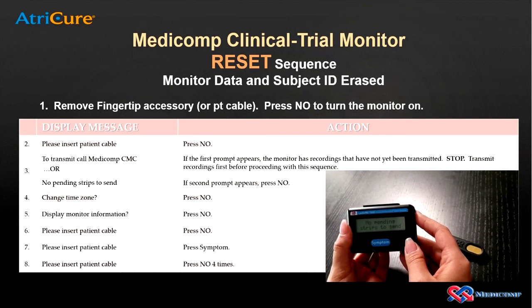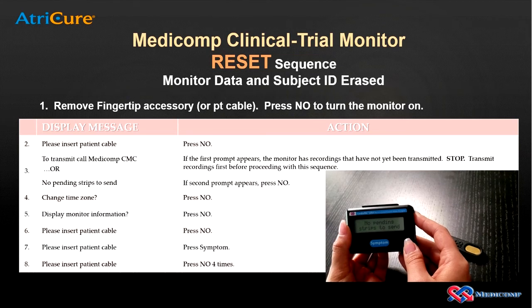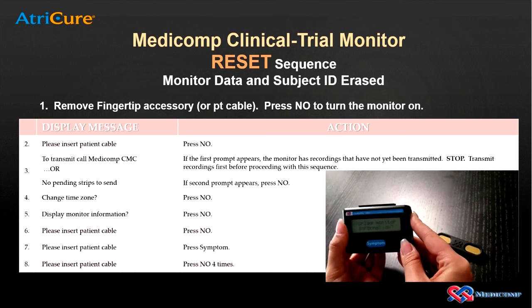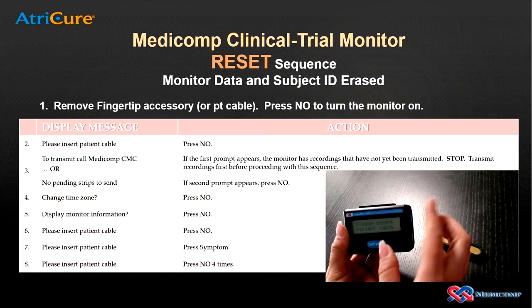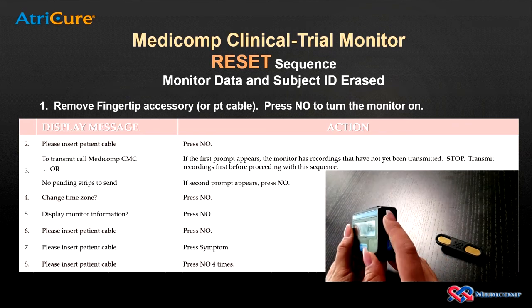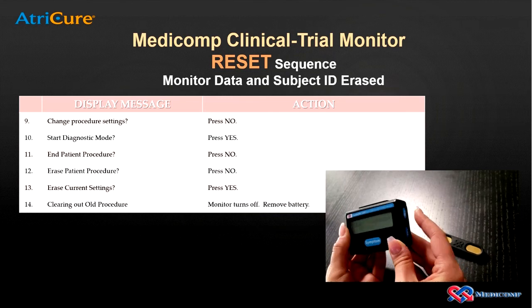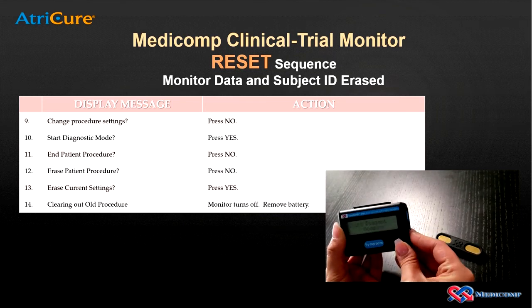If the screen does not display to transmit call Medicomp CMC, please go ahead and press the No button 4 more times. Then press the Symptom button once and the No button 5 more times. The screen should then display Start Diagnostic Mode. Press Yes once.